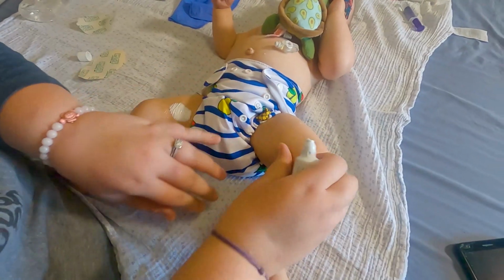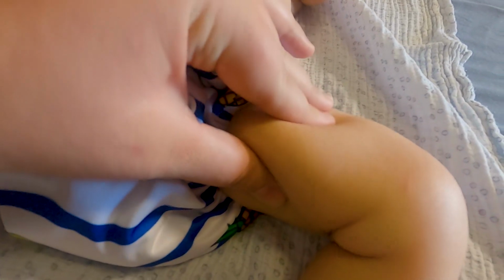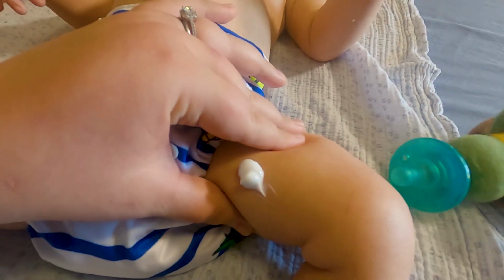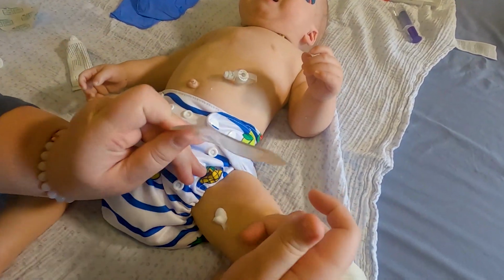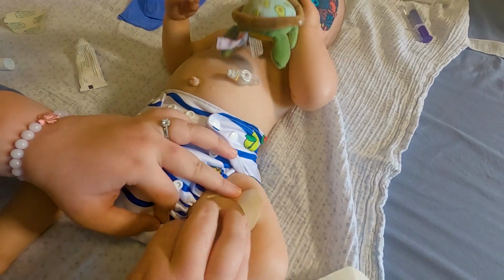And then we do the other leg again. Make sure the diaper is completely out of the way. We're going to pinch his little chunky chunk there. Is it funny? It's not funny, huh? And then open up your Tegaderm. Put it on there, spread it, and that's it.